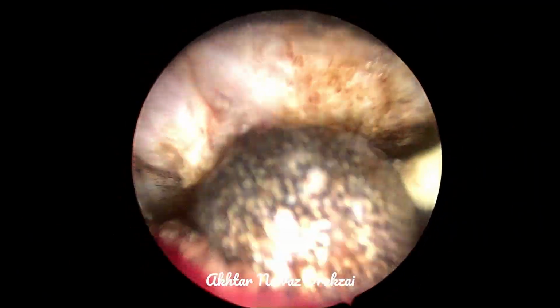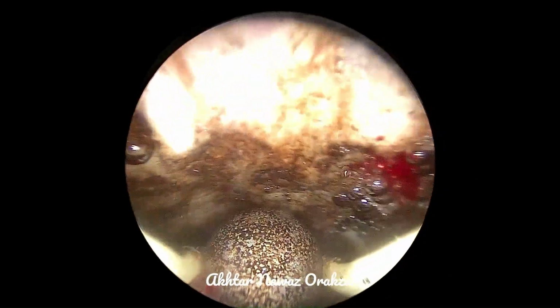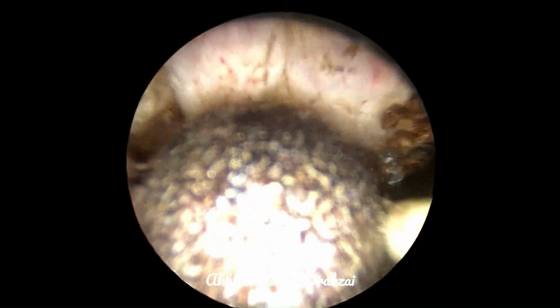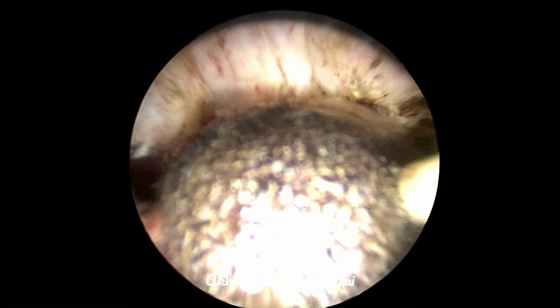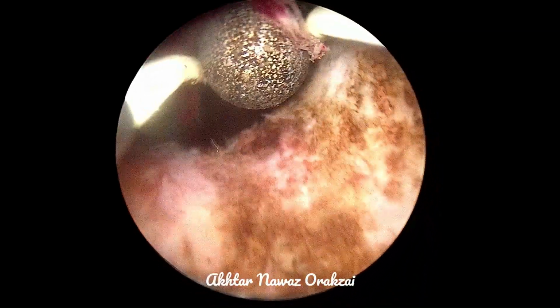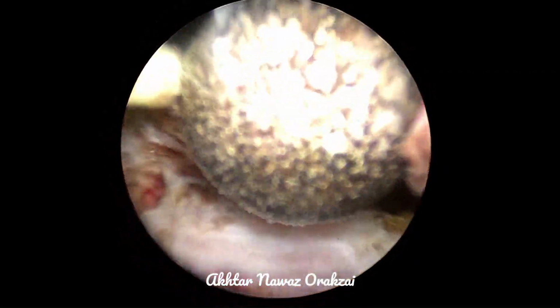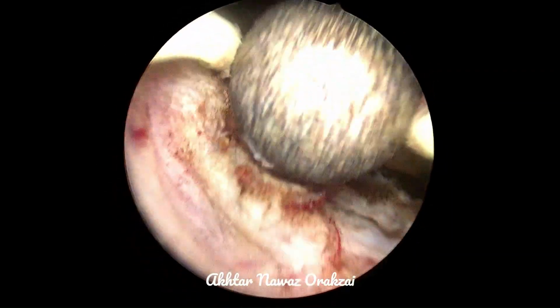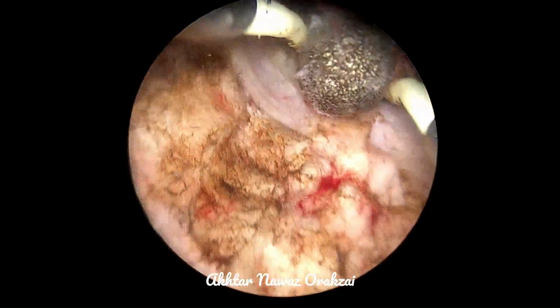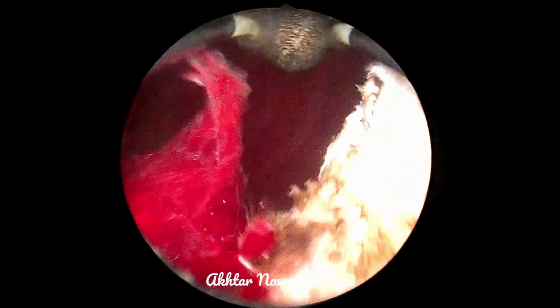But here I have made only a channel wide enough which will give the patient good symptomatic relief. Hopefully in the future I will share another video where more resection is performed in the prostate, and I will share that on my YouTube channel as well.